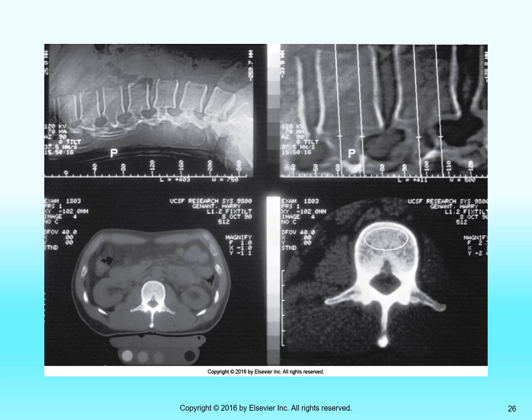But Hounsfield units are essentially attenuation measurements. So Hounsfield units or CT numbers can be converted very easily with different formulations programmed into the software, and you can make accurate measurements of bony mineral content with a CT scanner.